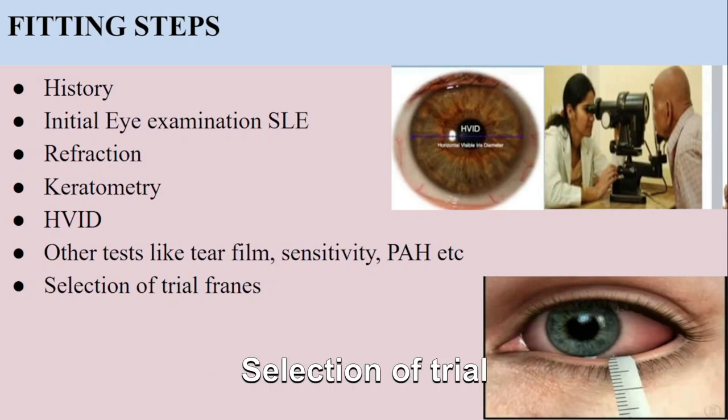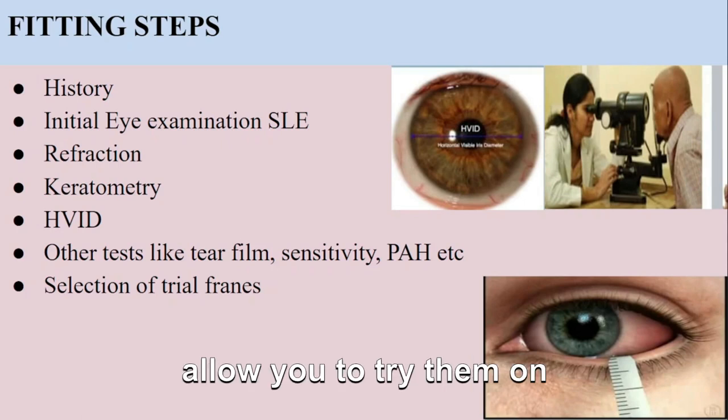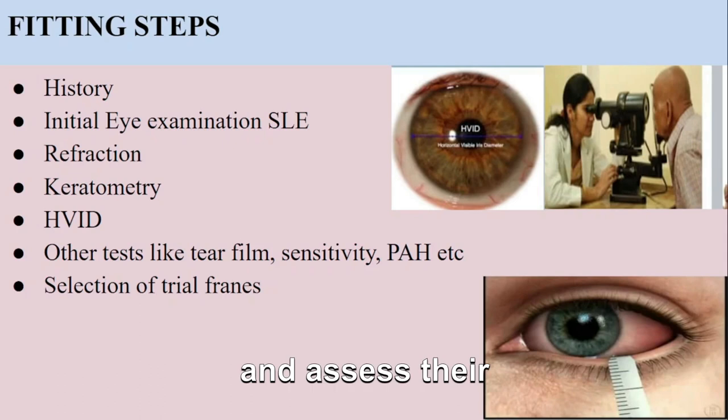7. Selection of trial lenses. Based on the information gathered from the previous steps, your eye care professional will select trial lenses that closely match your prescription, corneal shape, and other specific requirements. These trial lenses allow you to try them on and assess their comfort, fit, and visual acuity before finalizing the contact lens prescription. Each of these fitting steps is crucial in finding the right soft contact lenses for your eyes.